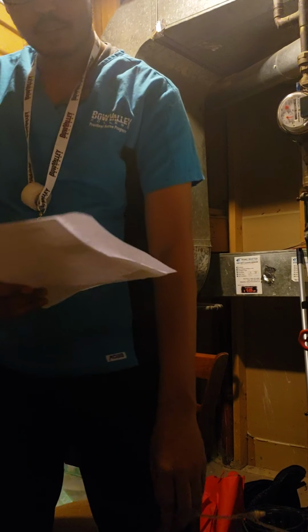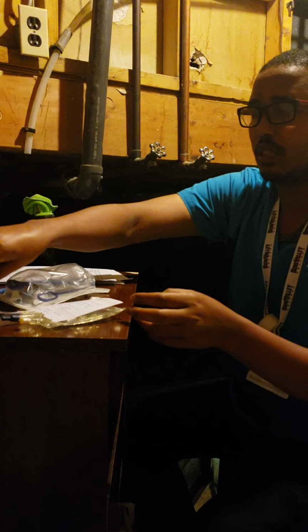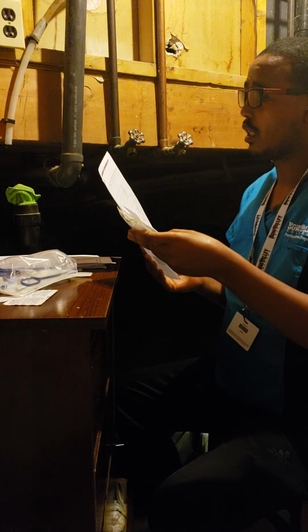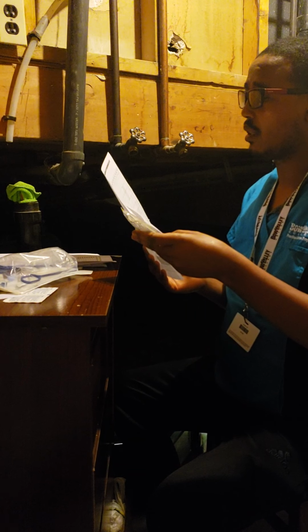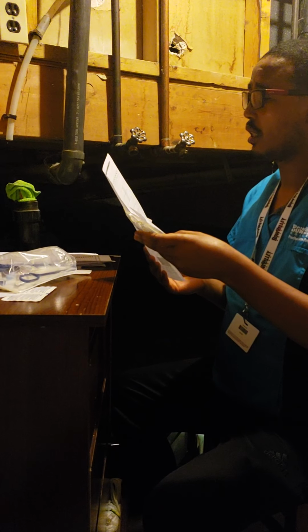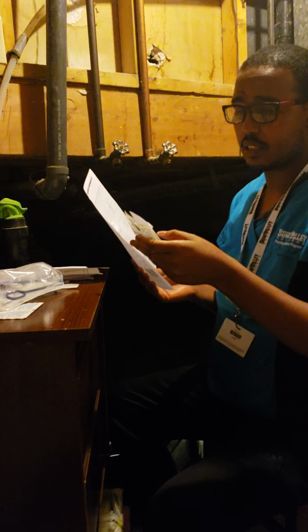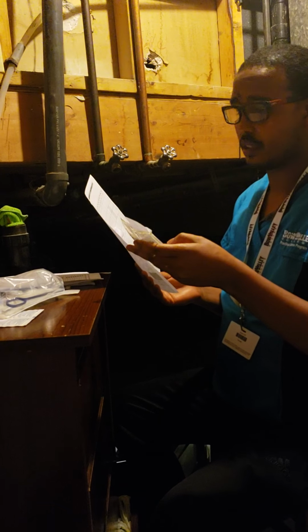The next step is, I have assessed all, so I have to do my third check with the monograph, MAR, and this is my mini bag solution. Chinocalicin, ID number 614773, date of birth 1960 December 11, and the ID over here is 614773, which is matching.